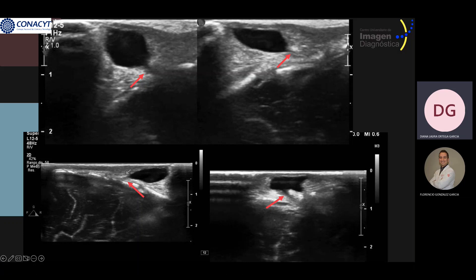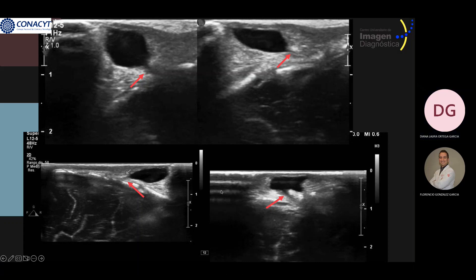These multiple images demonstrate the connection of the subscalp mass to the intracranial space via a small round defect in the os cranium, which is indicated with a red arrow.